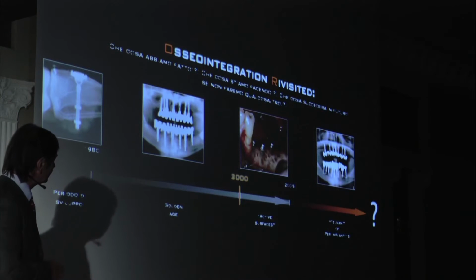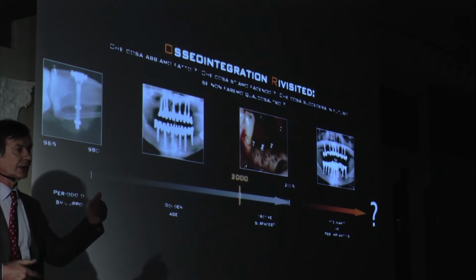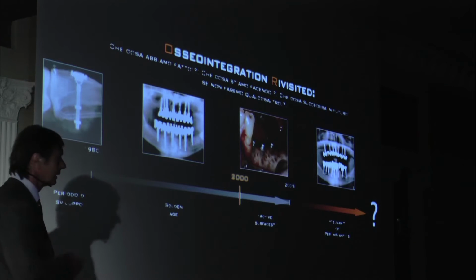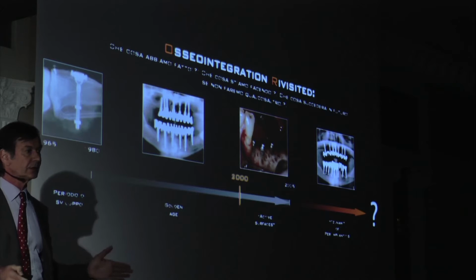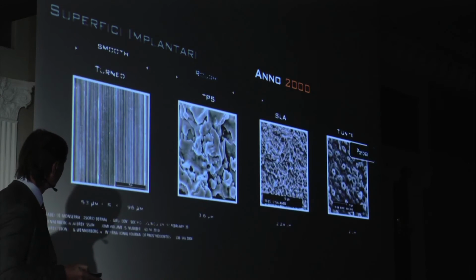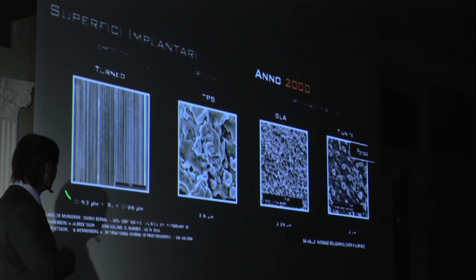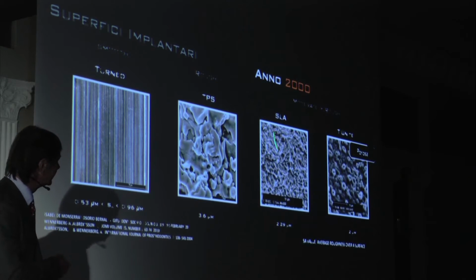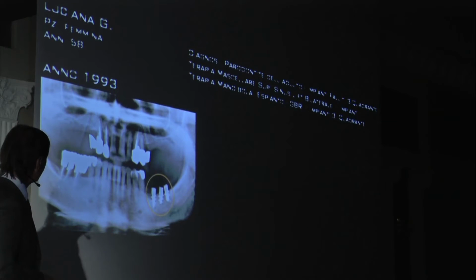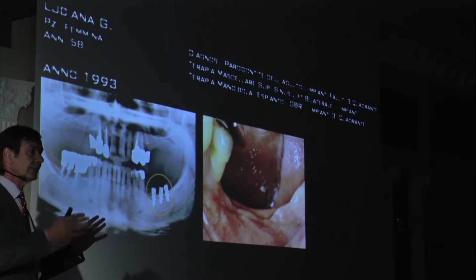But now let's cross the border of the year 2000. From the year 2000, we continue to do the same procedure, but we change the surfaces. From a smooth machine surface, we went to different kinds of rough surfaces. And this is a patient that was treated, before and after.